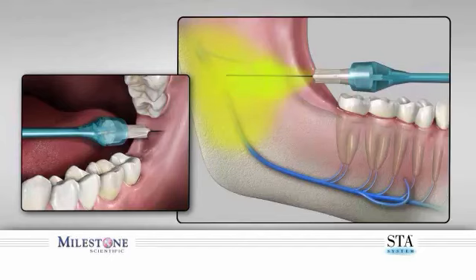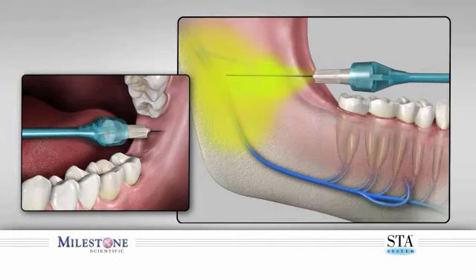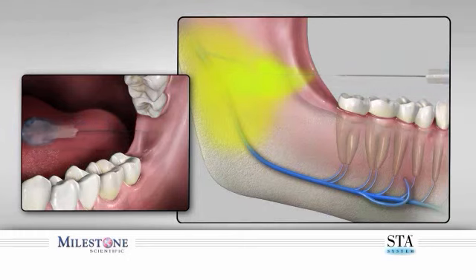To avoid anesthetic solution spray back into the patient's mouth, perform the following. While the needle is still embedded in the patient's tissue, depress and release the foot control pedal. Count 3 beeps after releasing the foot control, then totally remove the needle from within the patient's mouth. Direct the needle away from the patient as a small amount of anesthetic solution may still be present. Should you require more than 1 anesthetic cartridge, you can reload subsequent cartridges and continue as required. Please see section on multi-cartridge technique.